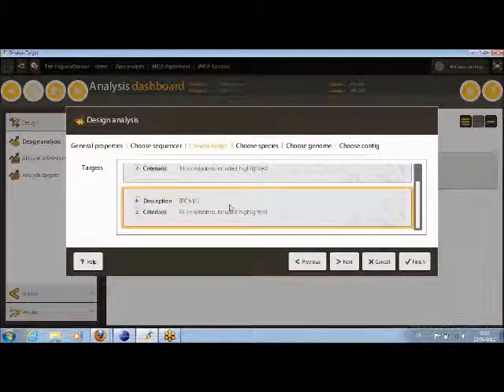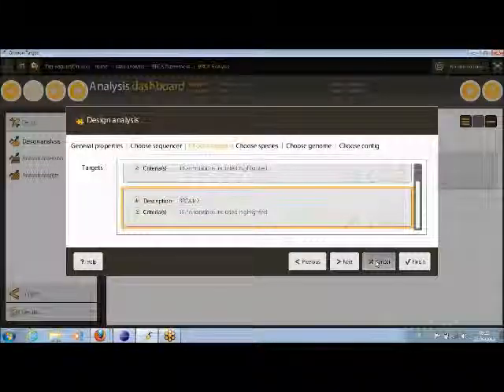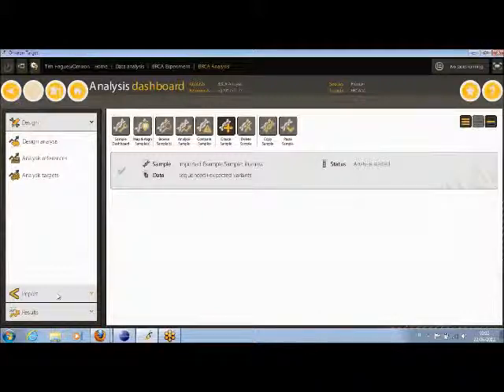So for example, you might want to configure one target for BRCA1 and one target for BRCA2, in which case you can split the analysis level and have one analysis that is for BRCA1 and one is for BRCA2, just for example. So you can also do slightly more specific configuration within an analysis if you want to.